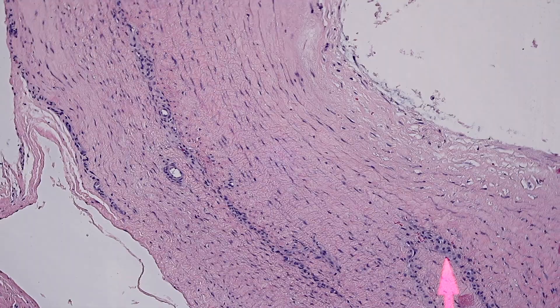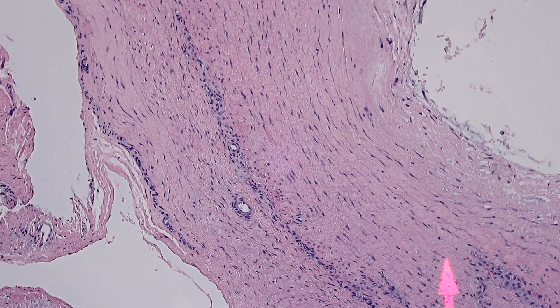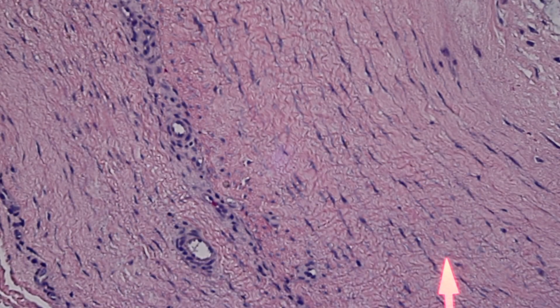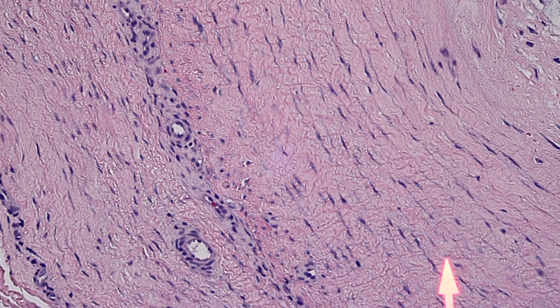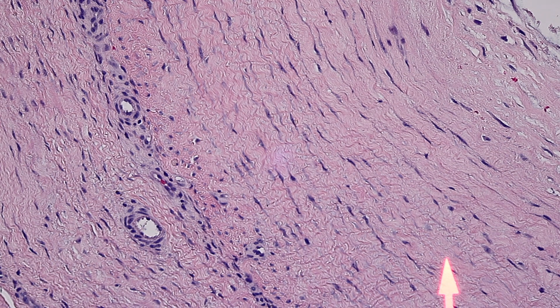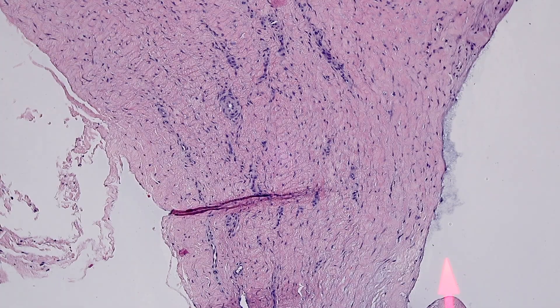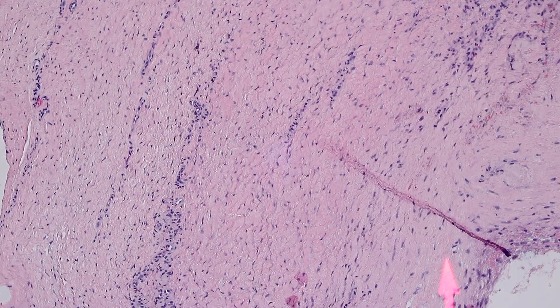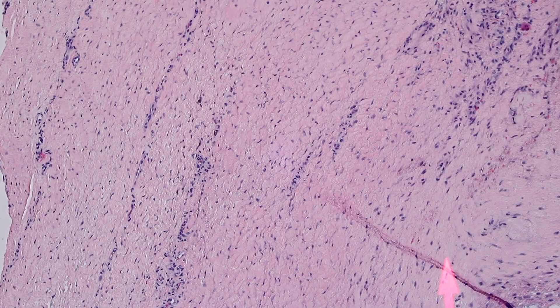This stuff out here is dense regular connective tissue — part of the tendon or fascia from the foot. It's really wavy, with super wavy collagen fibers and bland spindle cells in between. The really wavy stuff is usually not nerve; it's actually usually fibroblastic dense regular connective tissue like tendon or fascia. I have another video about how to tell that apart from nerve and I'll put a link in the comments below.